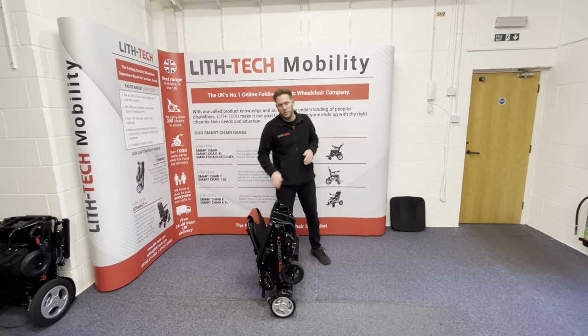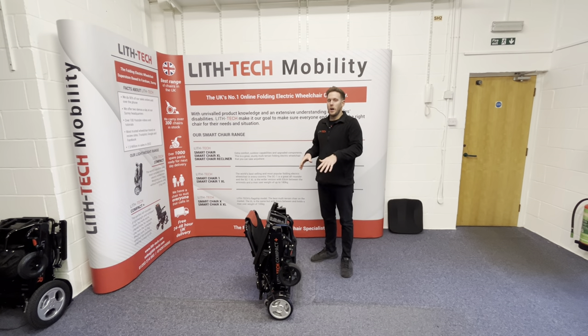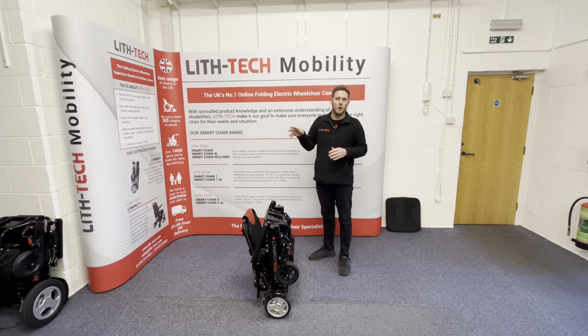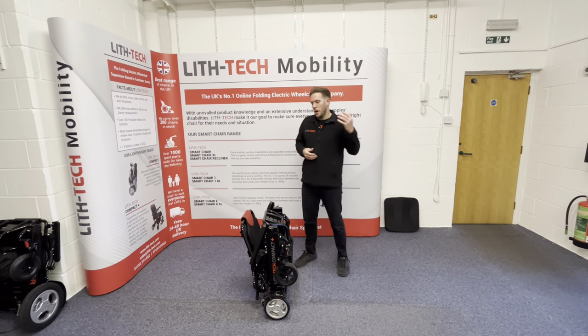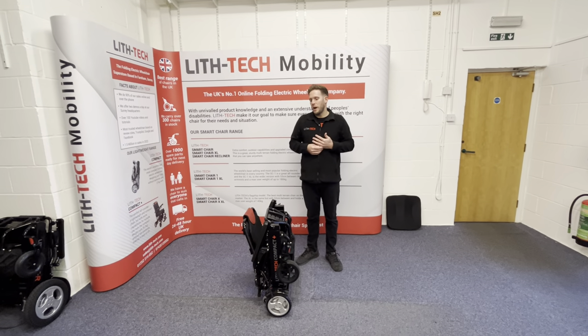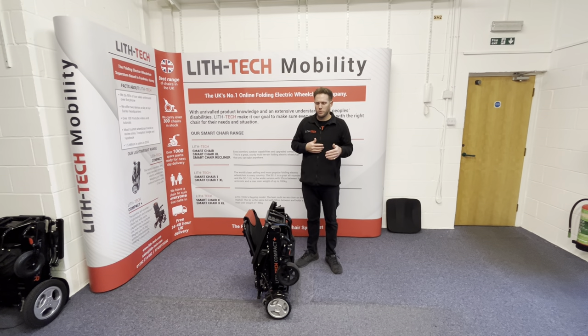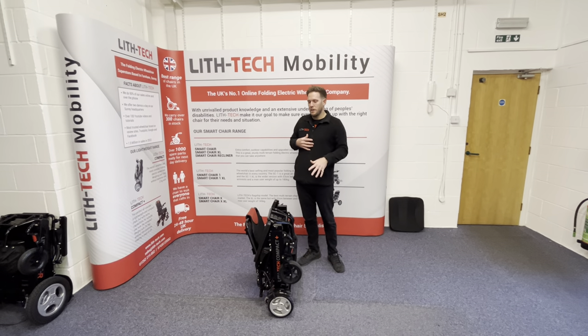This chair will take a safe user weight of up to 120 kilos. However, because it's a lightweight chair, really anyone over the 100 kilo mark should be going straight to the smart chair range. You've got bigger wheels, a more substantial frame, and they're usually slightly more spread out, which is going to be more comfortable for the larger individual as well. You still have to get the right chair for the right person.